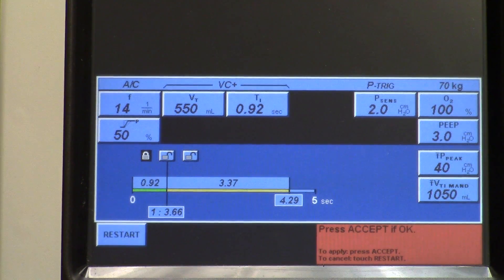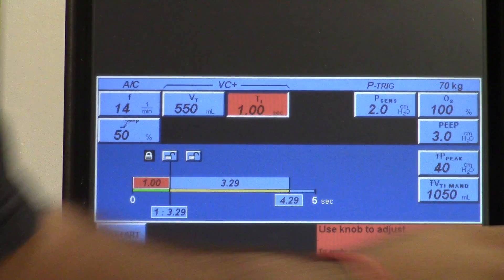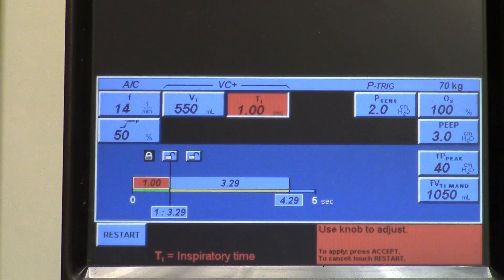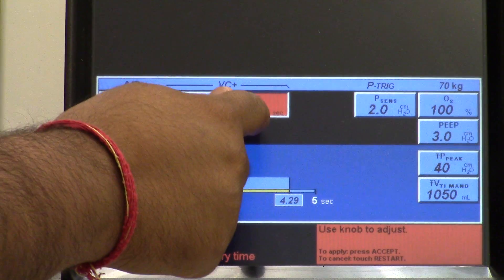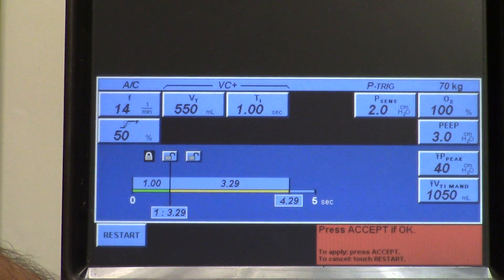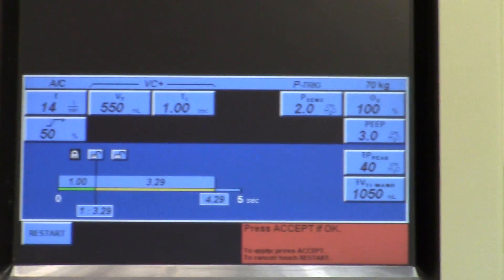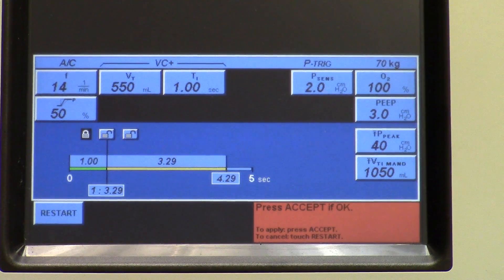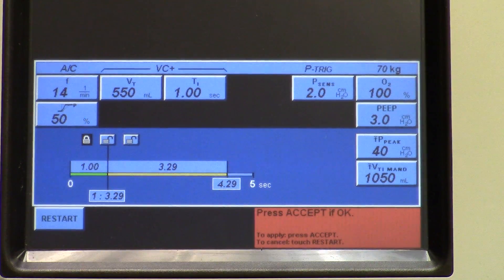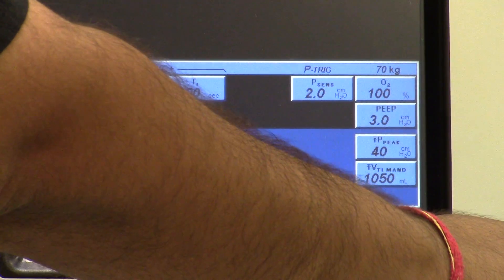This is how fast the air will go into the patient's lungs — it is called peak flow rate. Since we are on the VC+ setting, it's going to be I-time instead of peak flow. We set it for one second. The plateau is set to zero. VC+ doesn't have plateau, ramp, or square waveform settings. For rise time, we're going to set it to 20%.